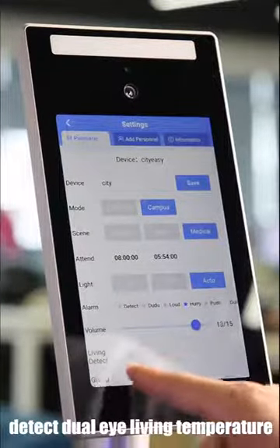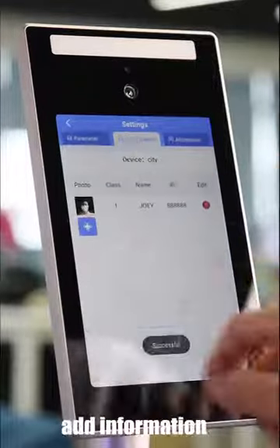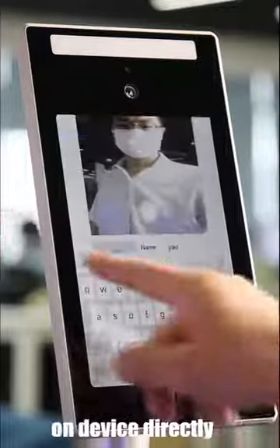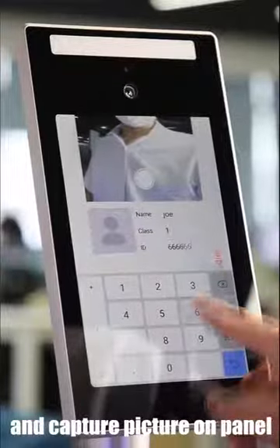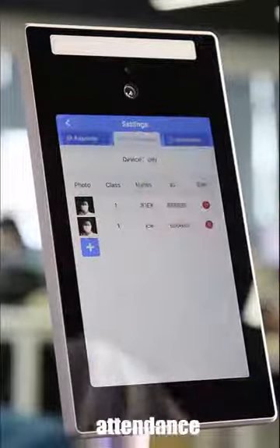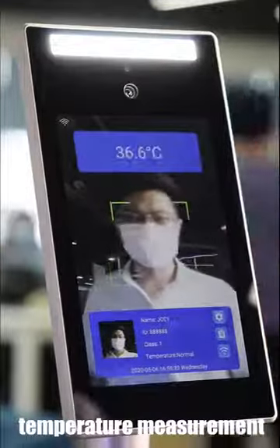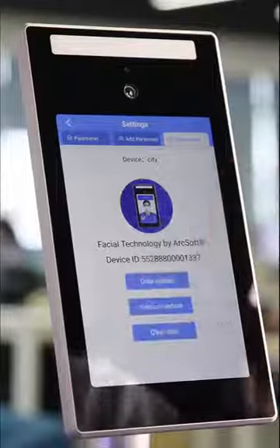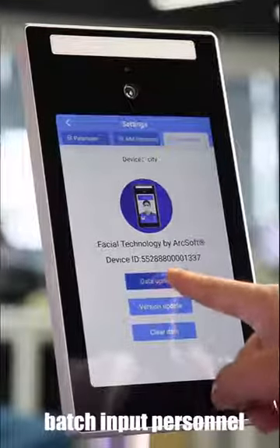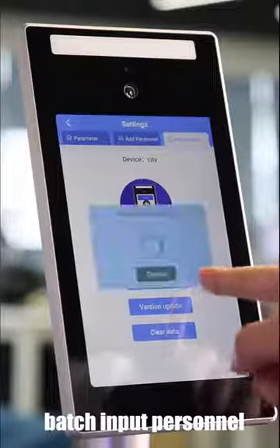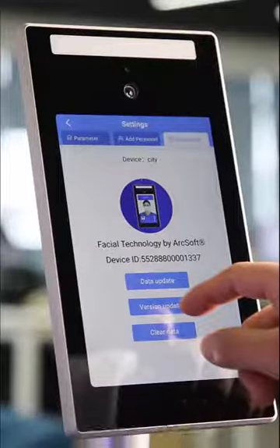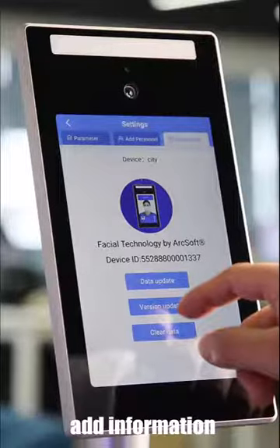Temperature personnel input: add information on device directly, add capture picture on panel. Attendance and temperature measurement. Fresh platform data, batching — put personnel information on PC platform, add information on panel screen.